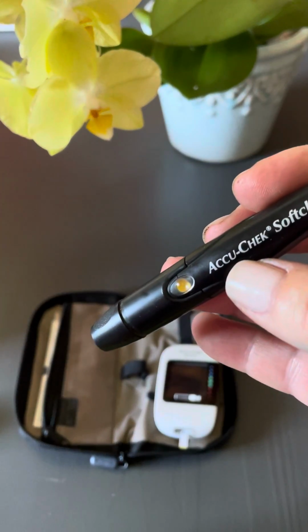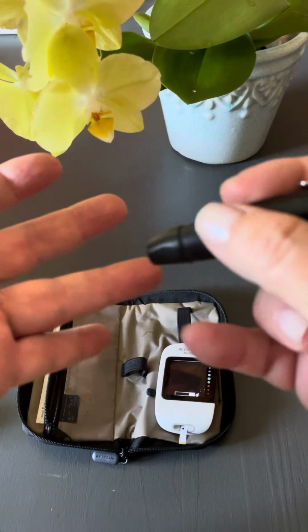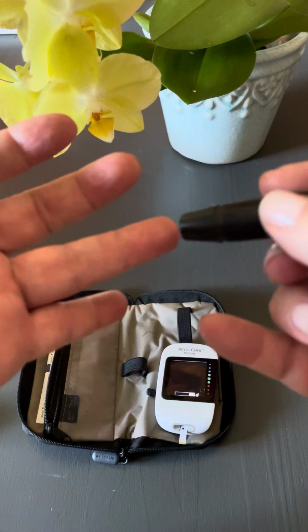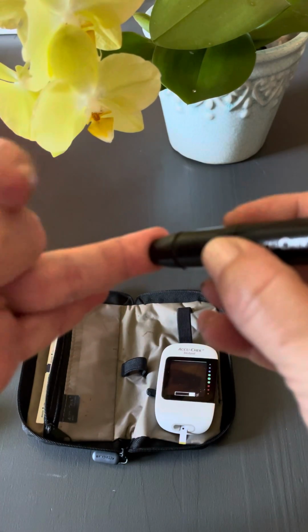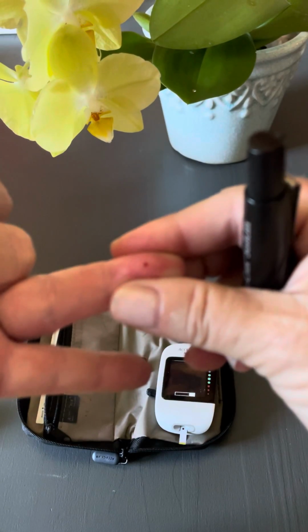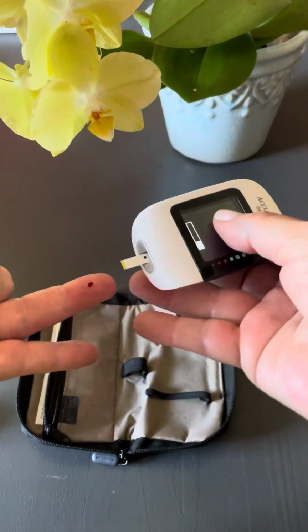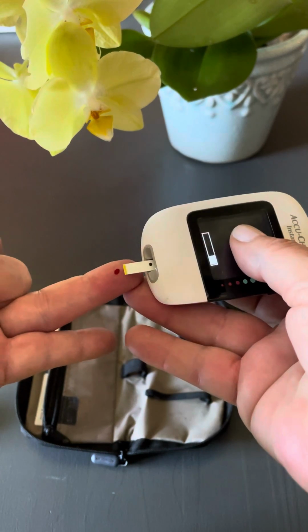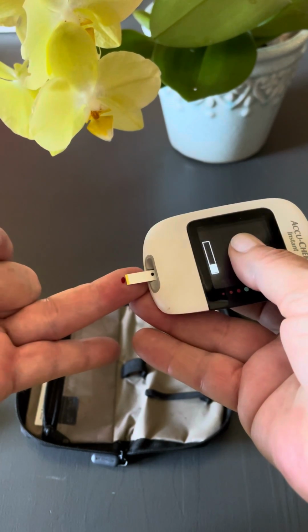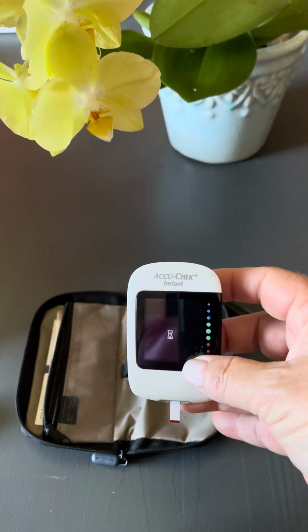I use this little soft clicks to make a small little puncture on the finger that I've cleaned. Get the drop of blood, and that goes onto the small strip to test the blood sugar.